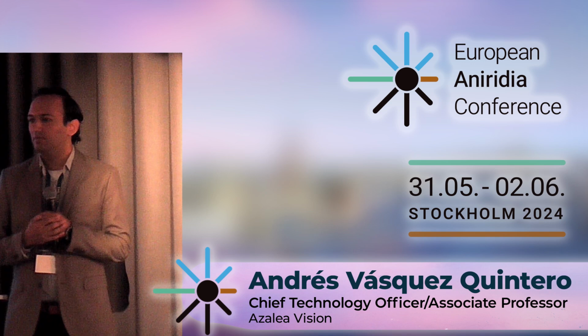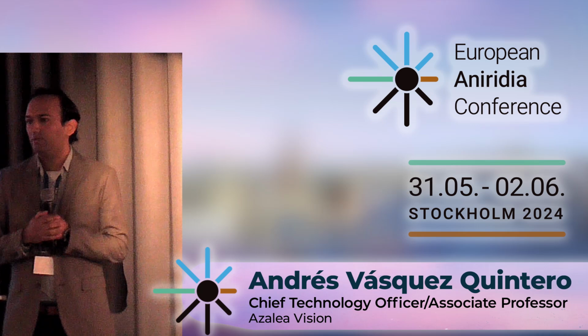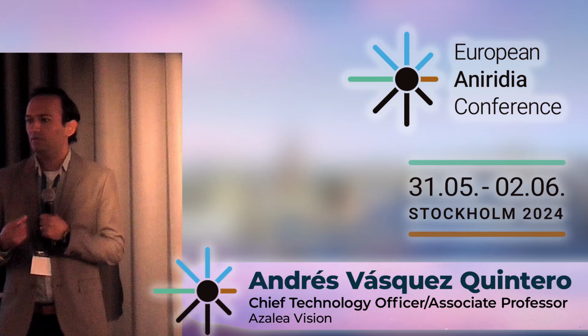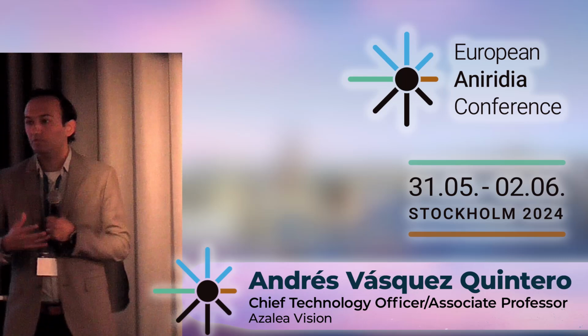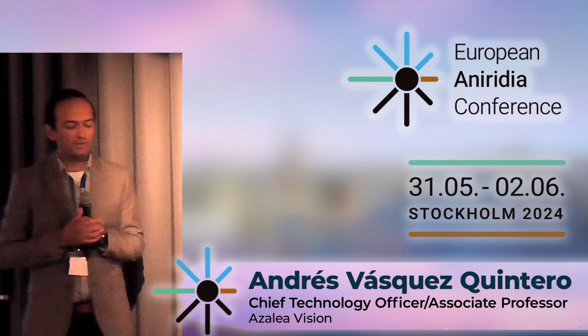So we're familiar also with all the developments in smart pupil research, because it's basically what we do as well. All the stories of AcuFocus, for example, which is a pinhole IOL, and all the stories of the drops for presbyopia, where you put drops and the pupil changes in size. Those have this advantage compared to our solution in that you cannot control the size, you cannot control the time, and also the long-term effects of these drops on the muscles are unknown. So yes, we have been thinking about putting this technology in an IOL, similar to the AcuFocus lens. Of course, technologically it's more challenging.